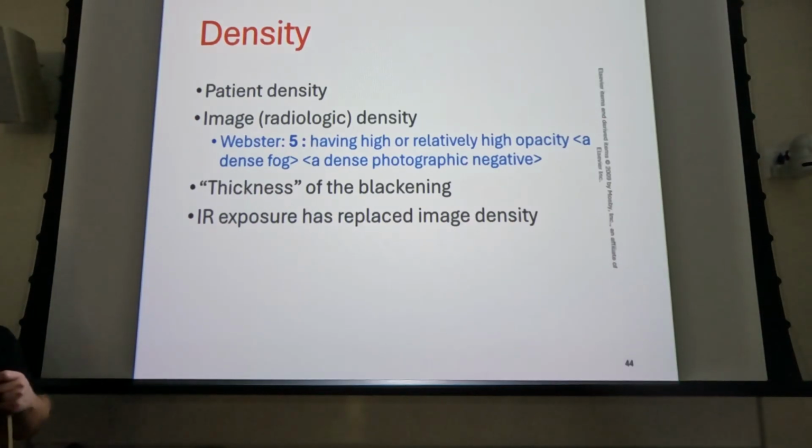So density applied to radiography is kind of the same thing. Is how thick is something? How thick is the darkening of the image versus how thick is the tissue type? Okay, so patient density is just that. It's how hard is it to penetrate through.